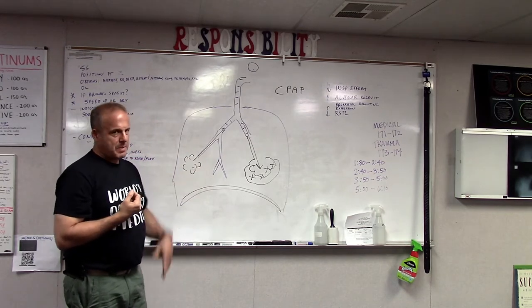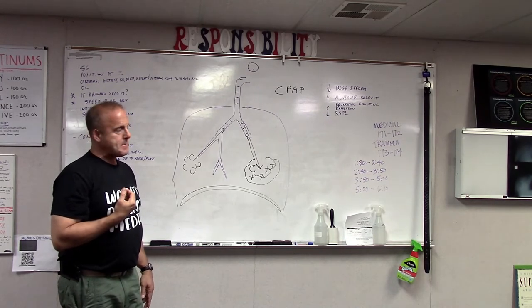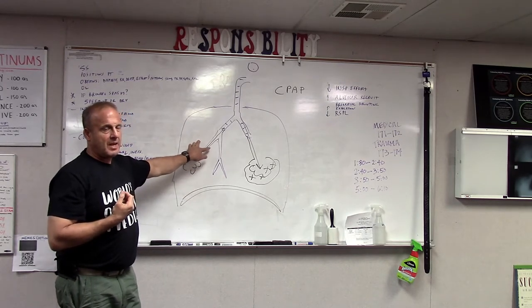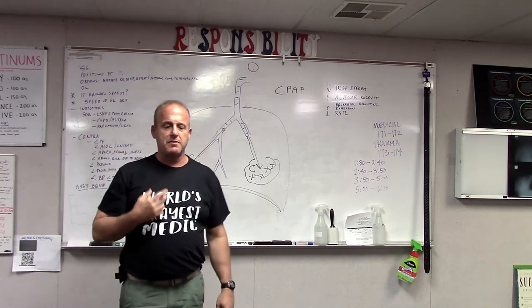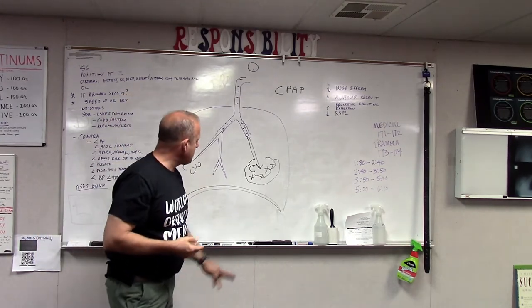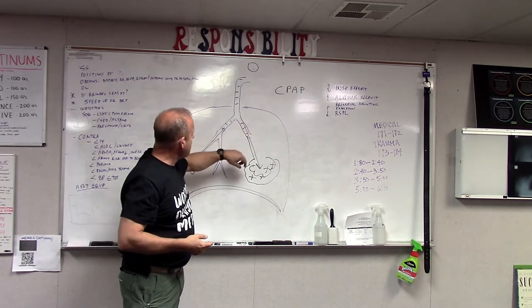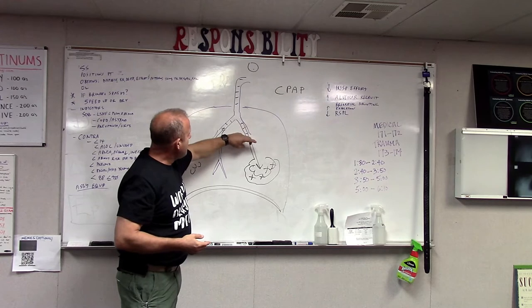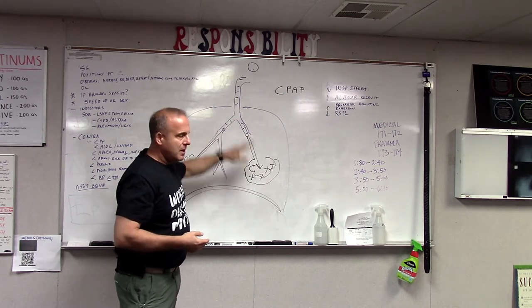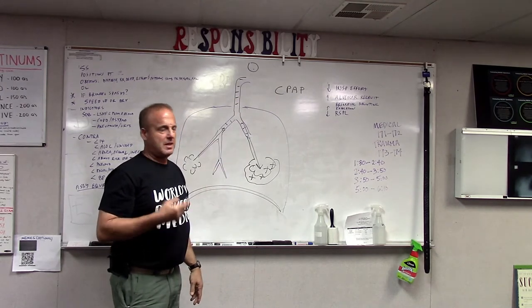So coming again to CPAP, via the continual positive airway pressure, CPAP helps splint these small airways. And provided the person with asthma has enough strength left to exhale against the resistance, they'll be able to push air out. Because just like a retreating rear guard, that rear pressure keeps holding open these airways so this gas can escape and hopefully the balance in breathing is re-attained.